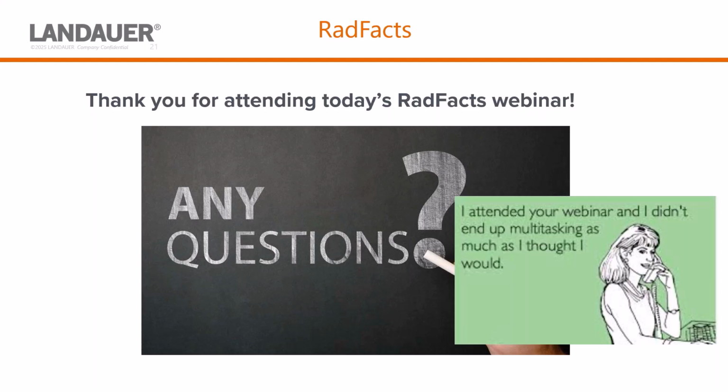All right, we've had a couple questions come in on when dosimeters need to be returned for analysis, and then how long it takes for the data to be entered into myLDR. So David, I can talk about the return. Do you know about the processing time? I don't have it at my fingertips.